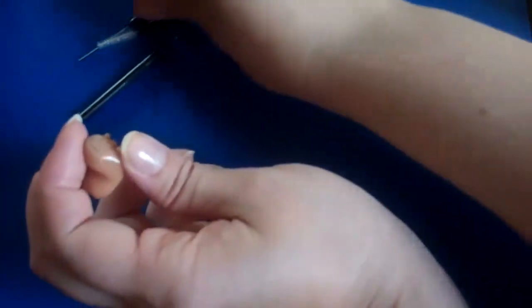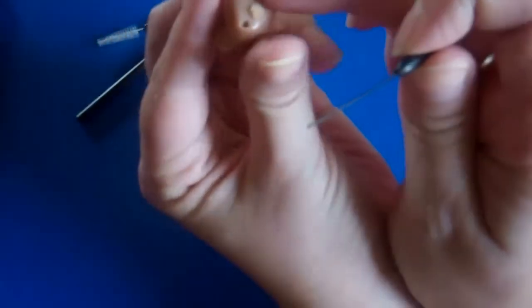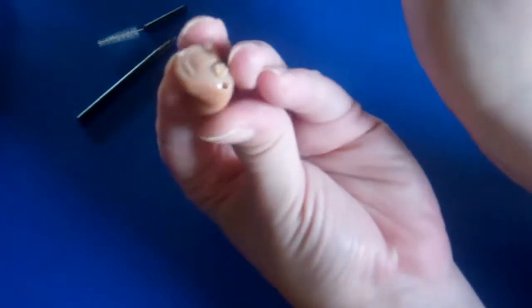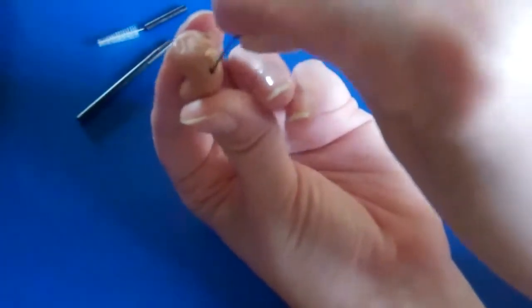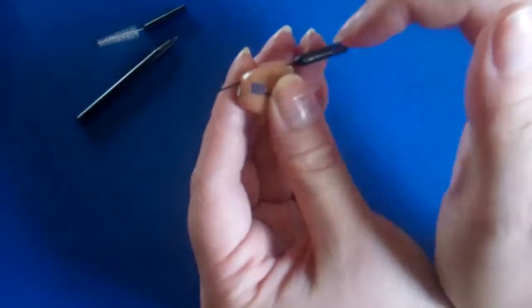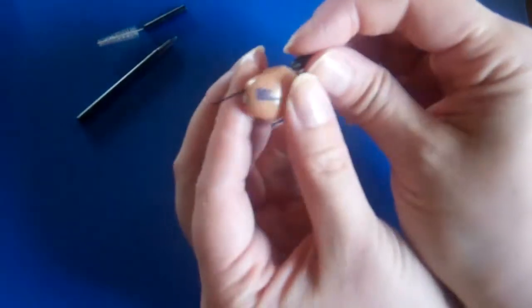The second tool that you get that's also very important is this little stick. Now, most every hearing aid has a tiny little hole that runs all the way through to the bottom. This is so the air can vent through the hearing aid and you don't feel very blocked up. This little stick here sticks in and all the way down to the bottom through that hole. You cannot do any damage with this stick, and so just go ahead and push it all the way through. The idea is that it will push out any wax or debris that's blocking the hole on the bottom.